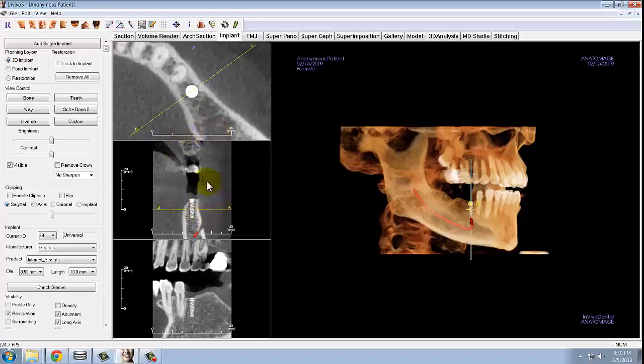Now that you have an accurate view for this cross section, you can either click and drag the implant to move it bodily, or click on the implant to use the yellow wheel to change the angle of the implant.